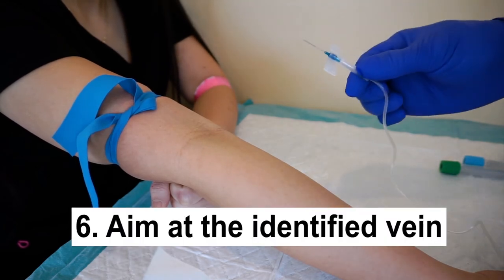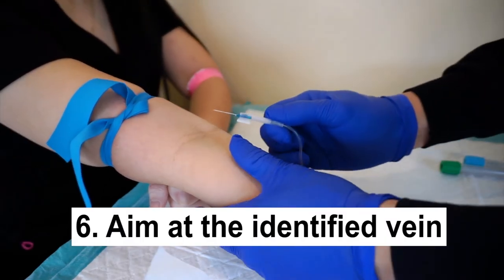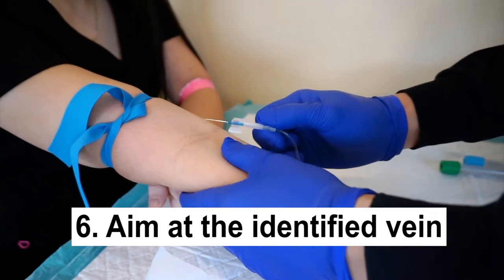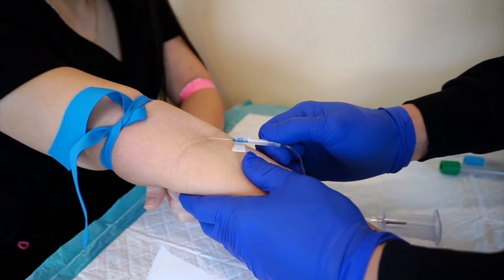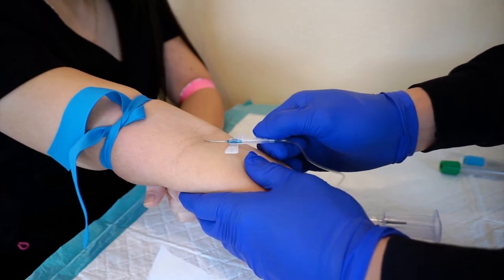Six, carefully handle the needle and aim at the identified vein. Keep your eye on the bevel. The bevel should be up and the pointed end of the needle is aiming at the vein.